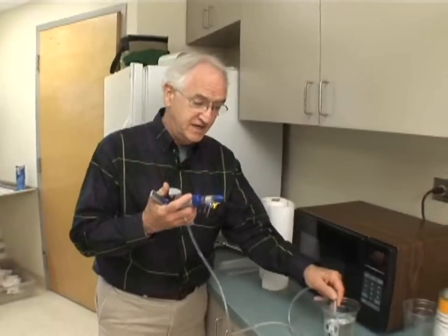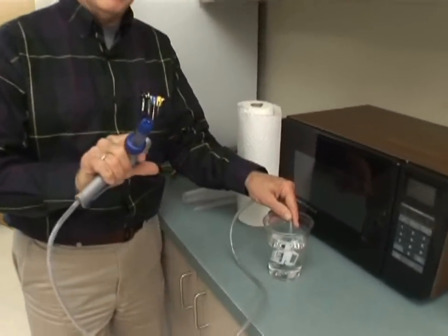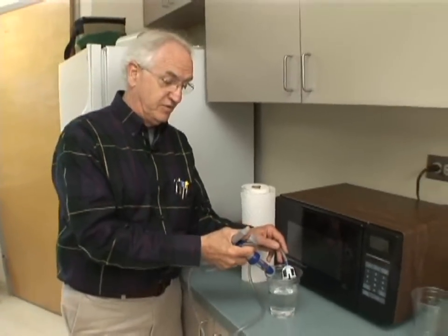I'm going to start by sucking some water up in this syringe. I don't need to have it completely full — I just need to get a little bit of water inside. In fact, I'd just as soon it not be completely full.